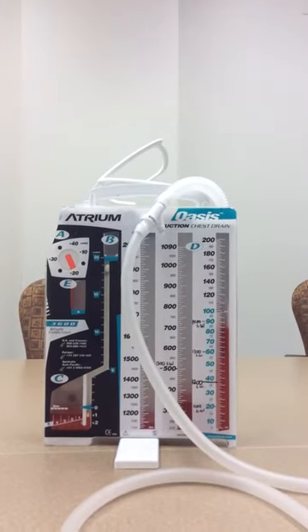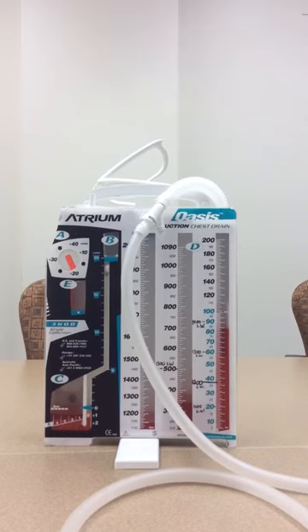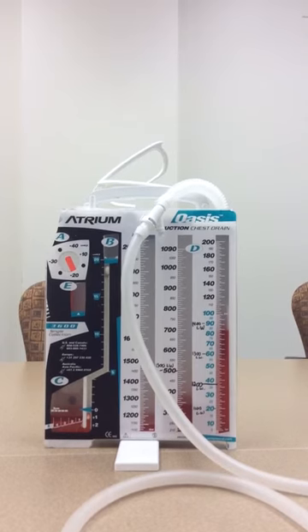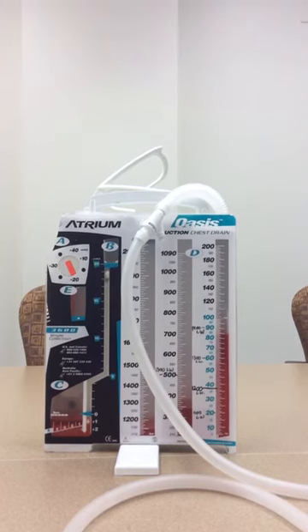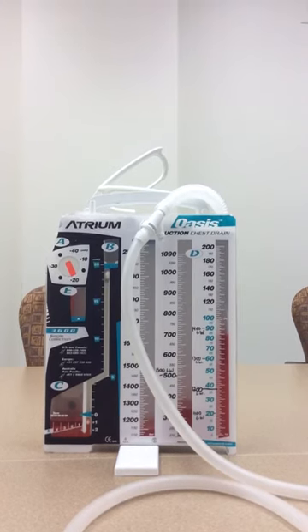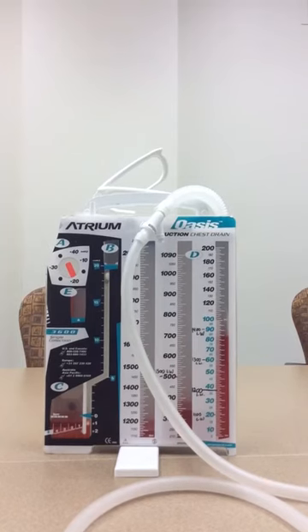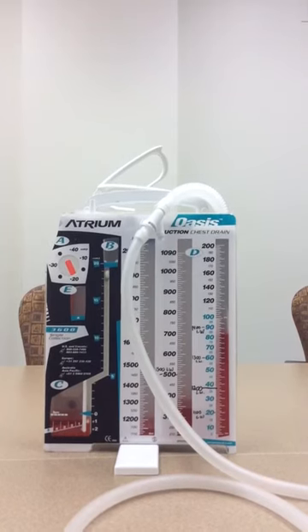After every shift and after every time that the drainage needs to be assessed every 15 minutes after the chest was first implemented, do that for four hours, then after that you have to do it hourly for the first 24 hours, then after that it's every eight hours.